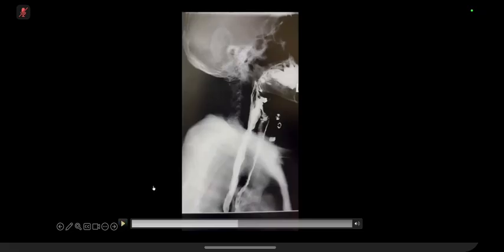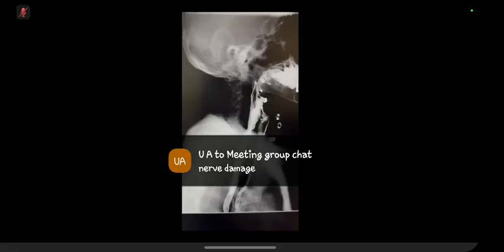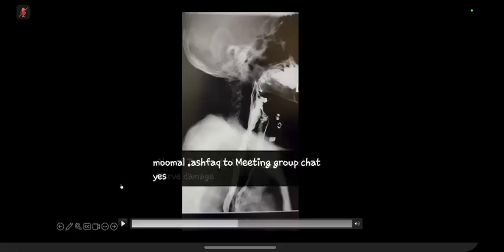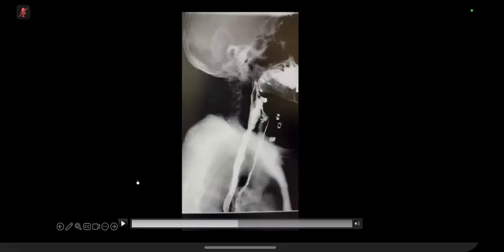Motility disorders, or age-related dysfunction. Yes. Anything else? Anything which can reduce the neuronal connections or the nerves and cause muscle paralysis or something like that. Phrenic nerve or vagal nerve injury. Yeah, you're on the right track.